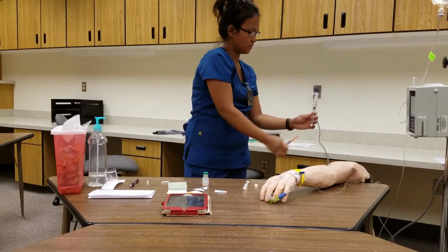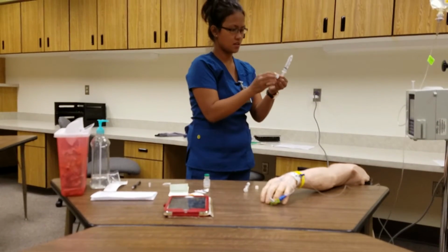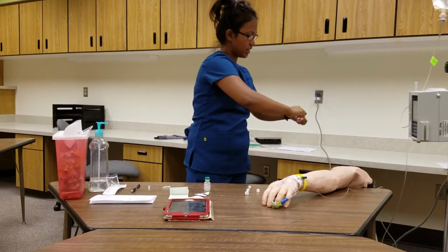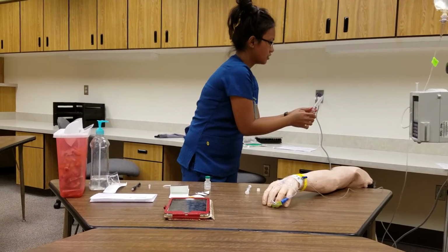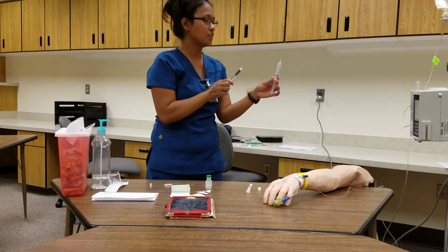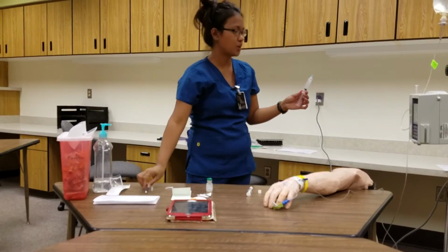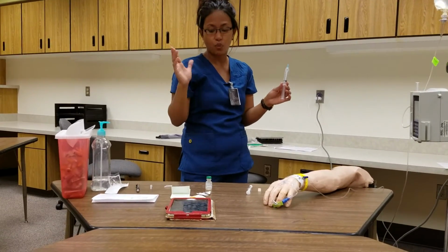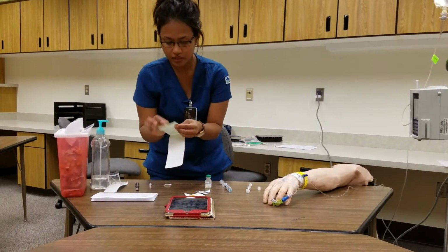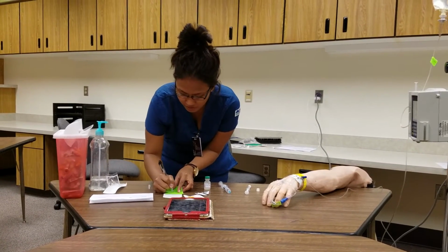Okay, make sure there's no air. Put it in my sharps container. Over my medication here, okay, looks good. If I see more bubbles, I just want to make sure there are none, and I want to make sure that I don't spill any medication, because morphine is pretty precious medication. I want to make sure I get all that 1 ml in my normal saline. After doing that, I label my morphine with date, time, and my initials.